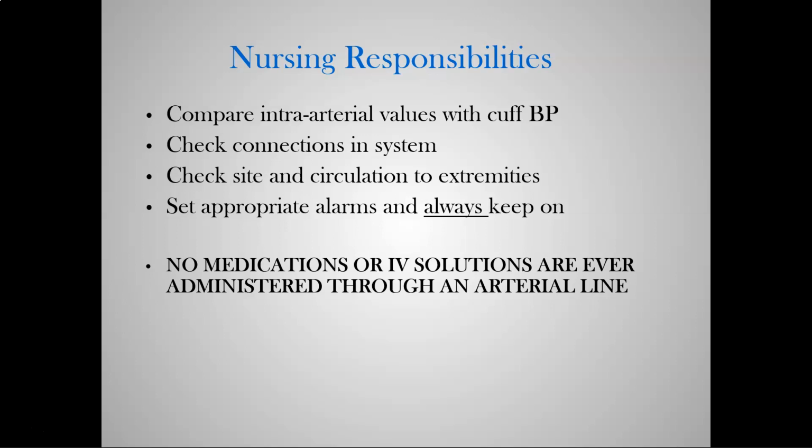For example, most of your vasoconstrictors typically are titrated off values such as a systolic equal to or above 90, or a MAP equal to or greater than 65. So when I have these values and I want to monitor them, I need to make sure I can go into the monitor and change my parameters to reflect exactly what I'm attempting to monitor. Okay.